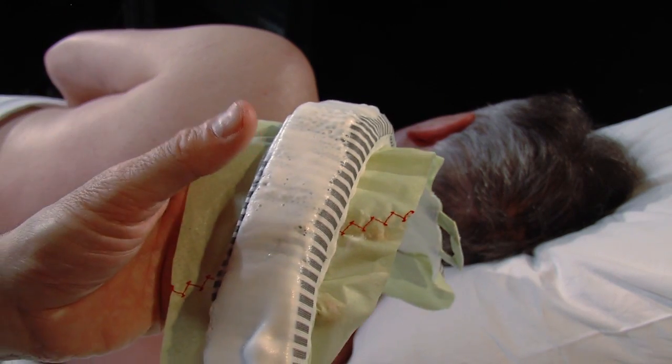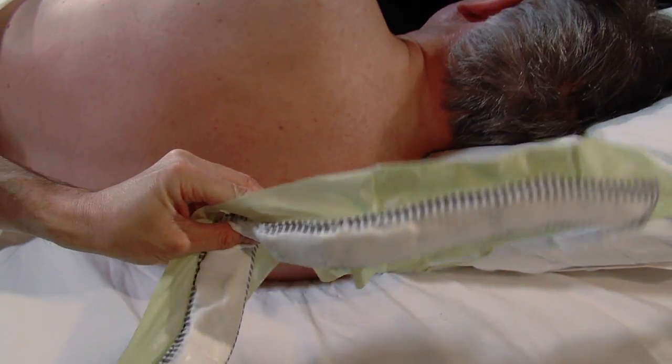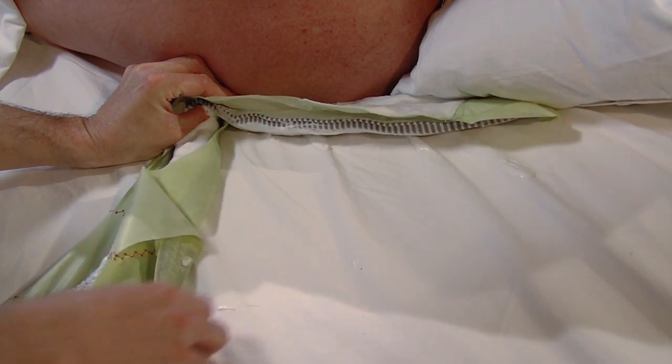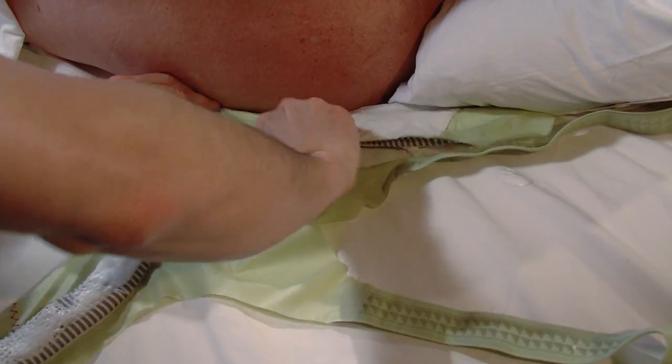Fold the sensor belt along the diagonal indicator line such that its end points towards the head. Now place the sensor belt next to the patient and spread the fabric as shown. Thereafter push the folded part underneath the patient's chest.